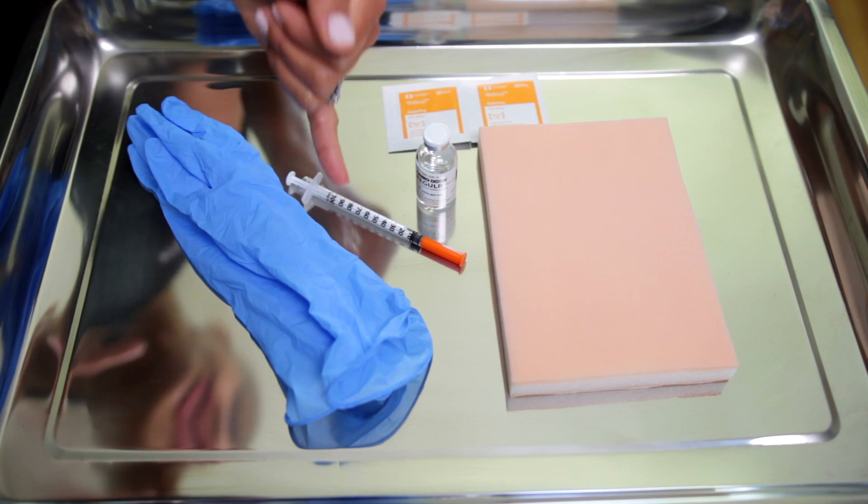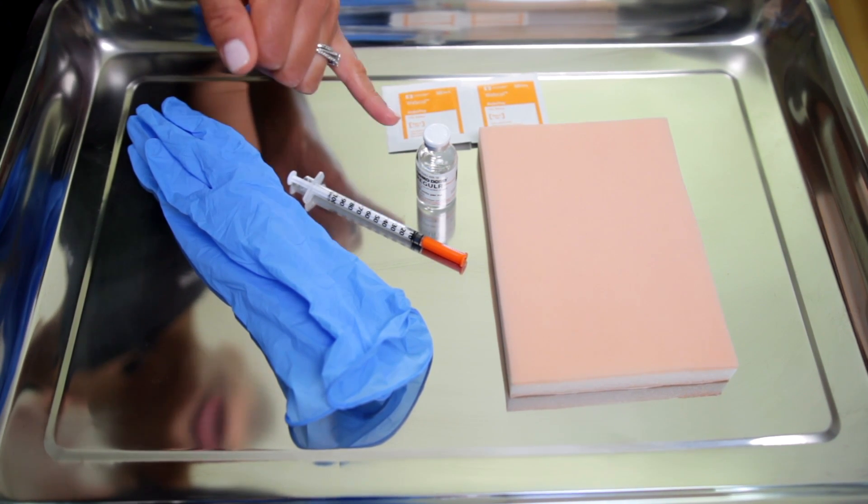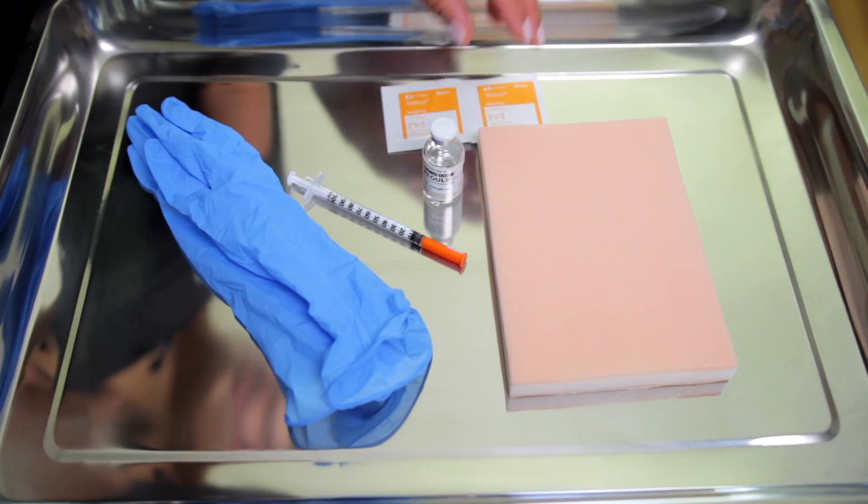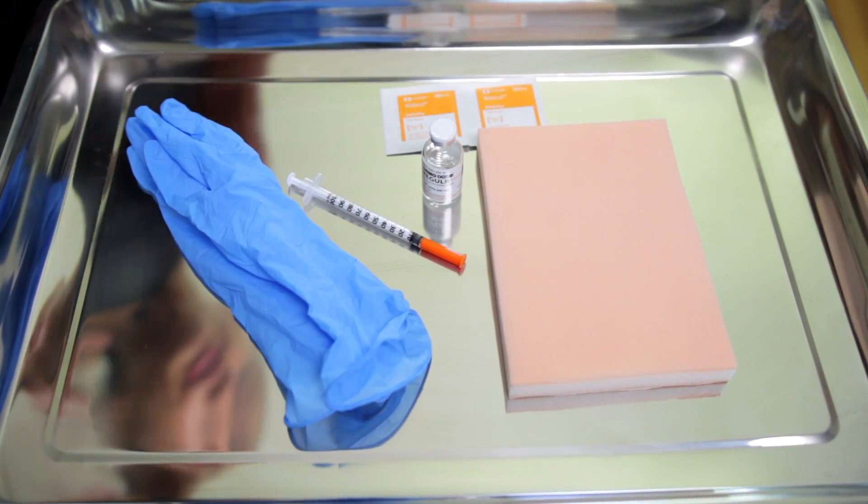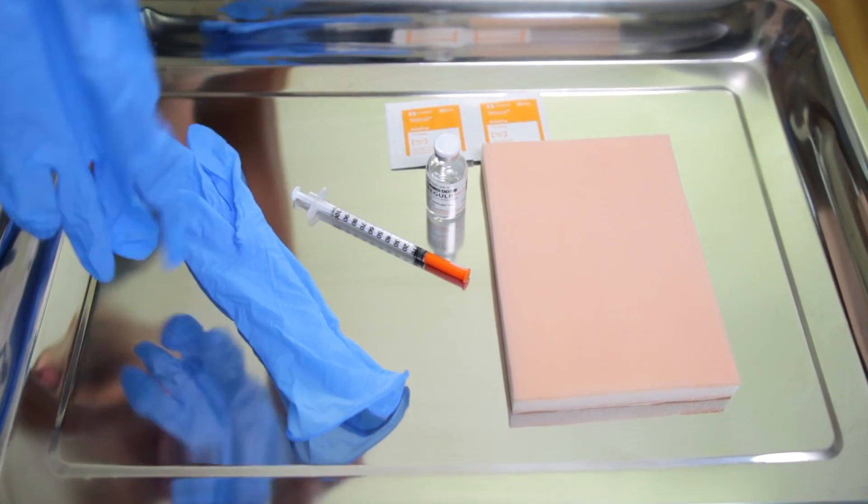So you have your insulin syringe, your pair of gloves, the right insulin for administration, which is regular insulin in this scenario, and then you have your alcohol prep. So after you've washed your hands, you're going to put on your gloves.